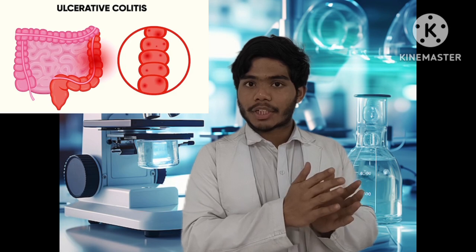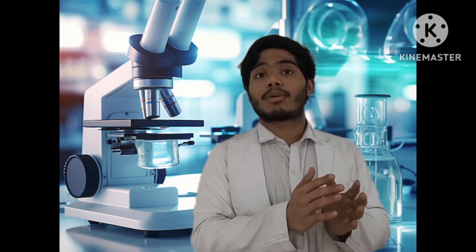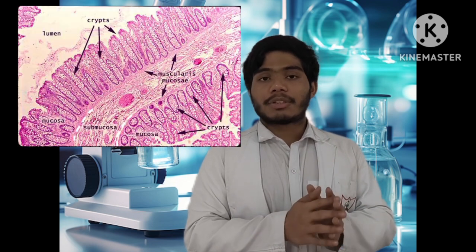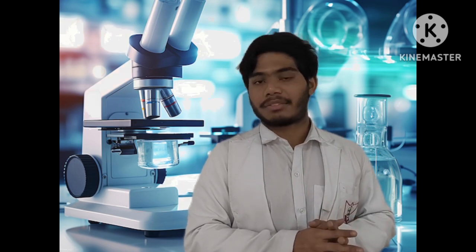So in this video I am going to discuss the microscopic features of ulcerative colitis and Crohn's disease. But before discussing these microscopic features, I want to discuss the histophysiological diagrams of intestine, because ulcerative colitis and Crohn's disease are pathological conditions, so it is better to know the normal findings first. So let's begin with the histophysiological diagrams of intestine.